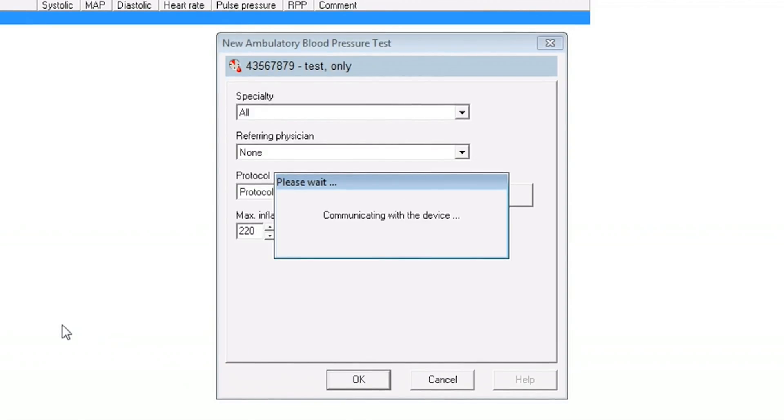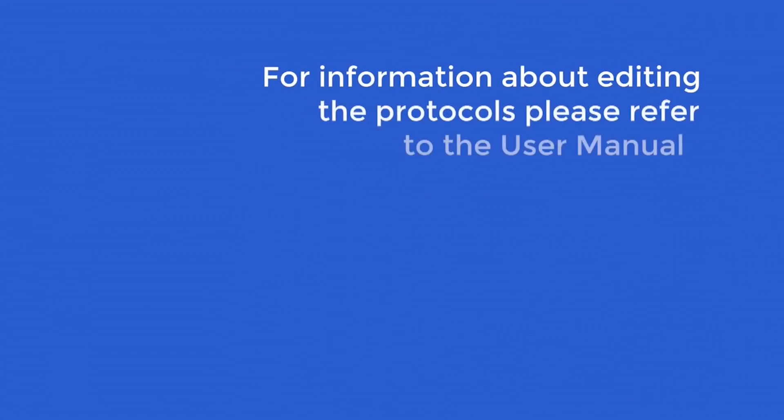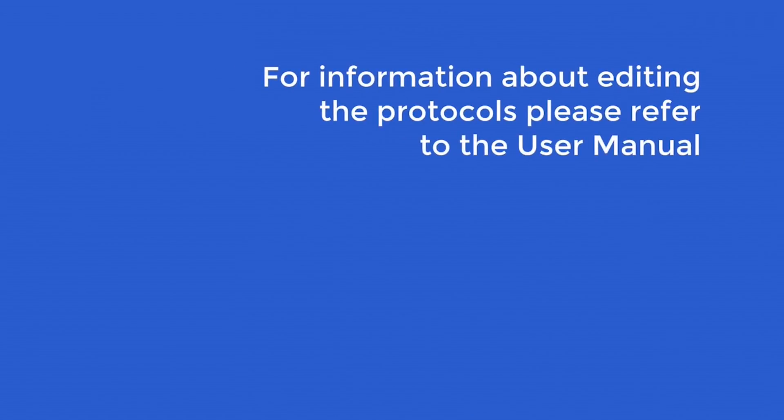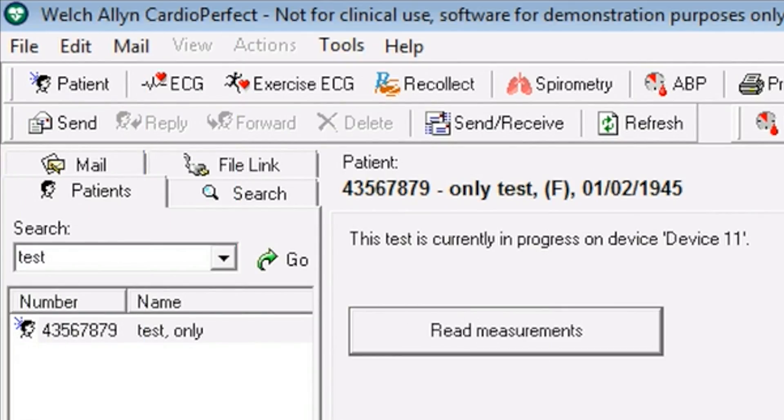The device will be programmed with the patient ID, protocol, date, and time. For information about editing the protocols, please refer to the user manual. Once programmed, the screen indicates the test is in progress on the device, at which point you can disconnect the USB interface cable from the unit.